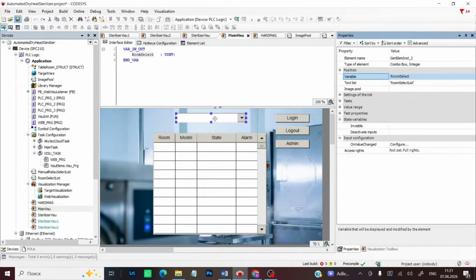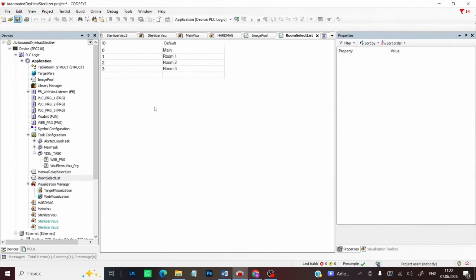Next, I added a drop-down list for selecting a room and linked the variable I declared in the Interface Editor tab to the variable field, and attached the list I created to the text list field. As you can see, this list is responsible for navigating between visualization screens, where selecting Main will display the main page to the user, and the other values will show the visualization of a specific sterilizer model installed in a particular room of the medical facility.